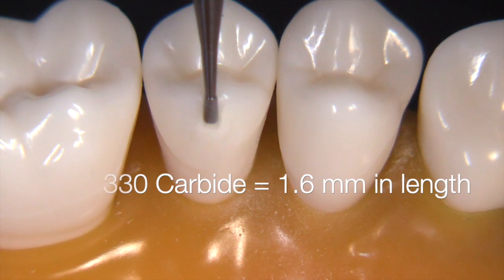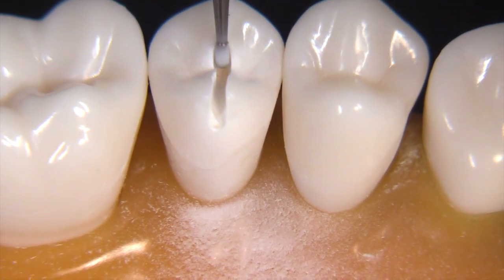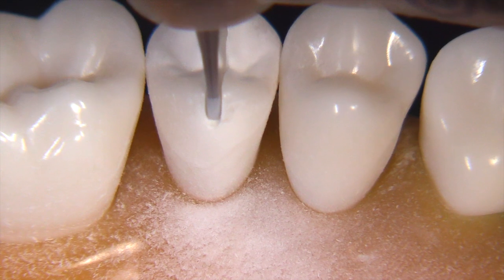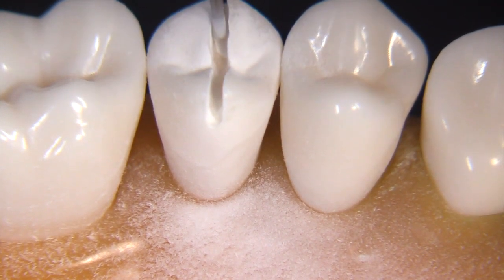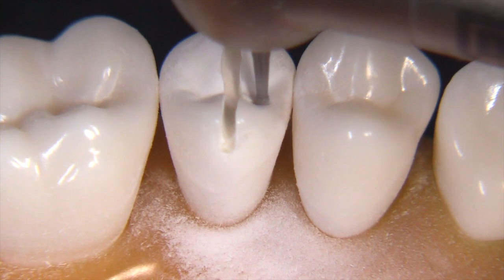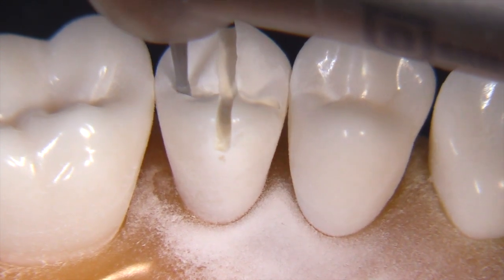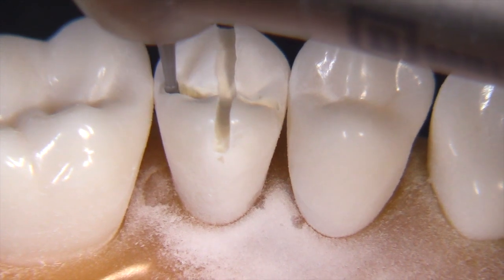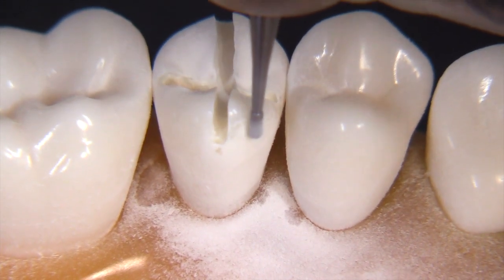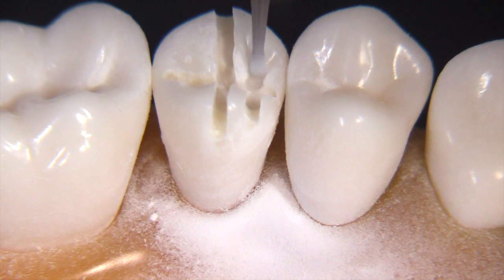We're going to utilize a 330 carbide burr, which is 1.6 millimeters in length, to establish little slots along the occlusal. I'll place three of these across the occlusal from a buccal to lingual direction, and one along the central groove area. It's nice to use this vertical preparation technique to obtain a very accurate reduction — we don't even need to check the occlusal clearance if we follow this technique carefully. The burr should be extended into the preparation all the way to the depth of the flutes.